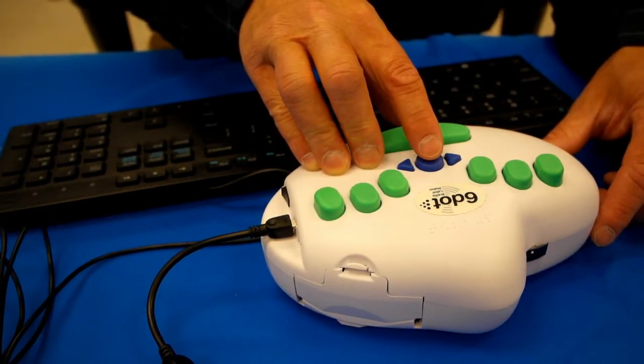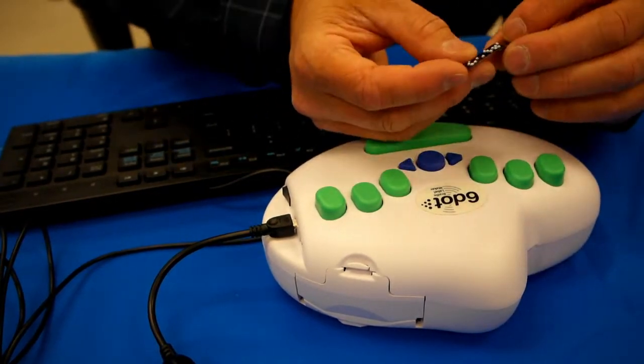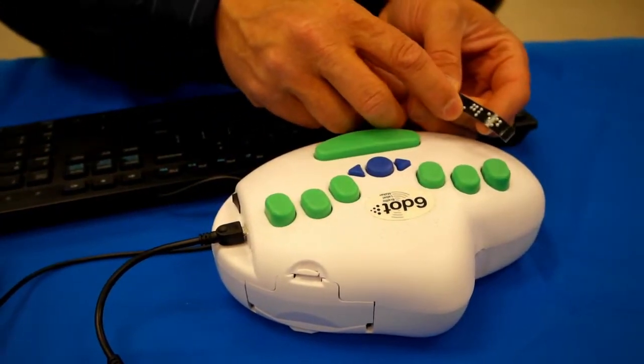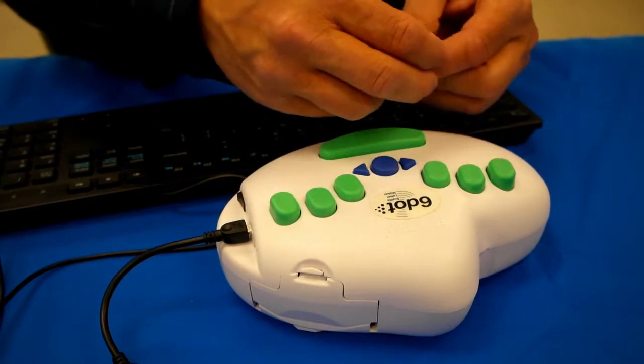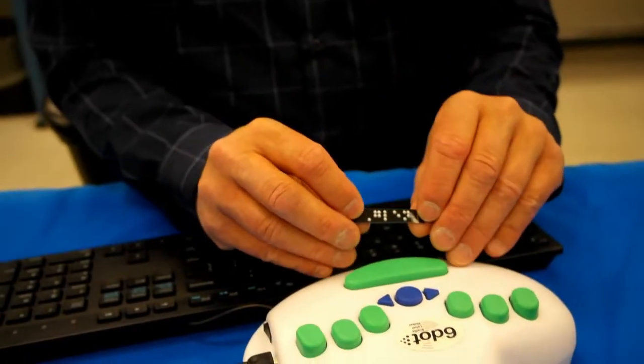Now that it's done, I press the round button in the middle. I'll pull that out, and you can see I've got the dot six for the capital, the G-L-E-N-N. And I can peel it, and I now have my name in braille.